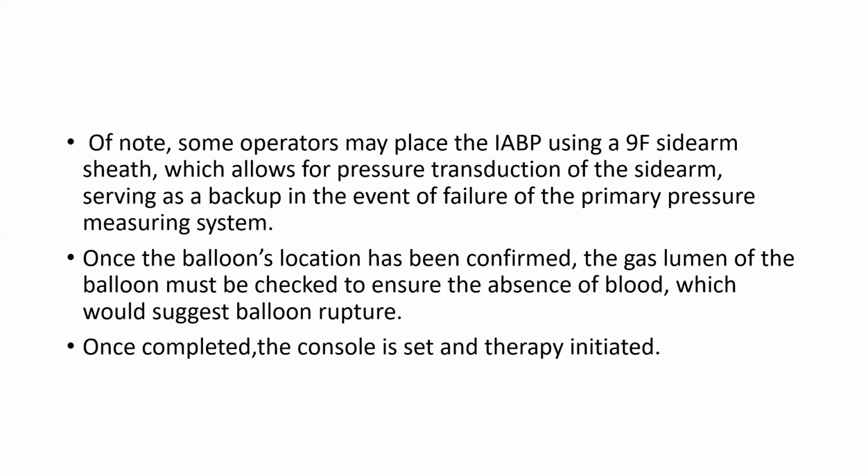Once the balloon's location has been confirmed, the gas lumen of the balloon must be checked to ensure the absence of blood, which would suggest balloon rupture. Once completed, the console is set and therapy is initiated.